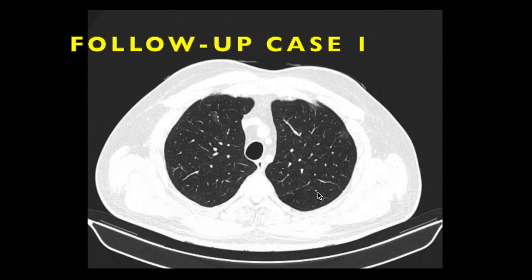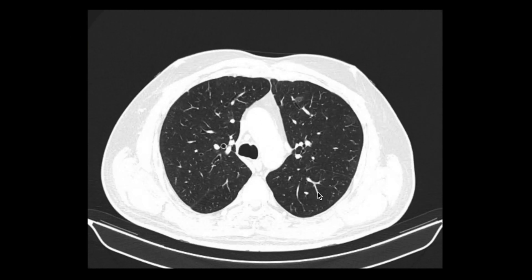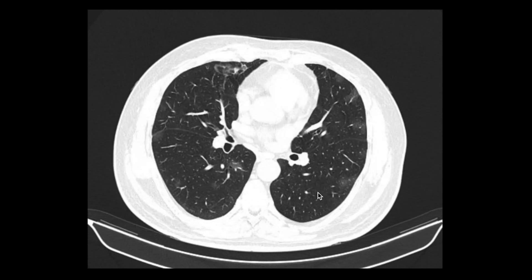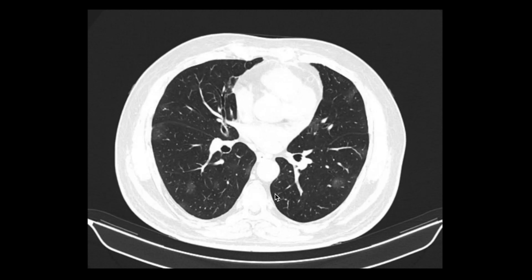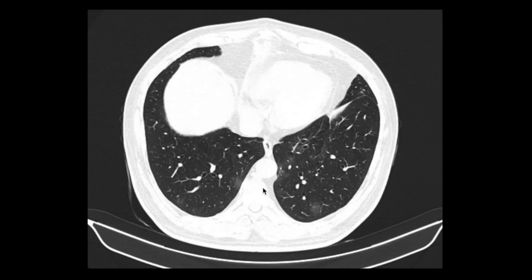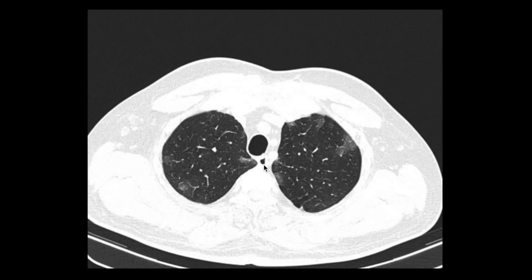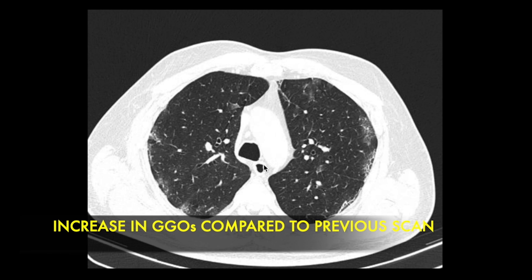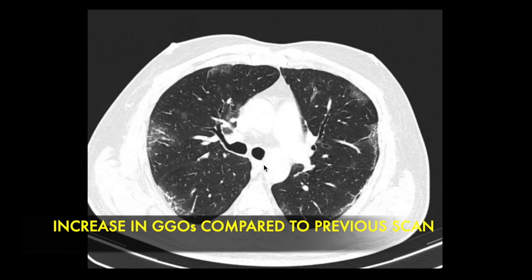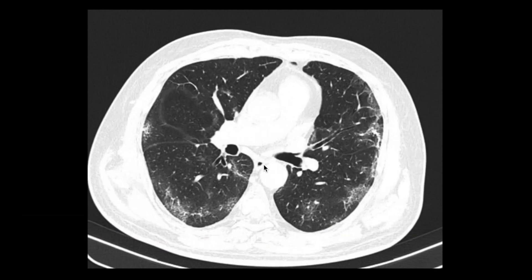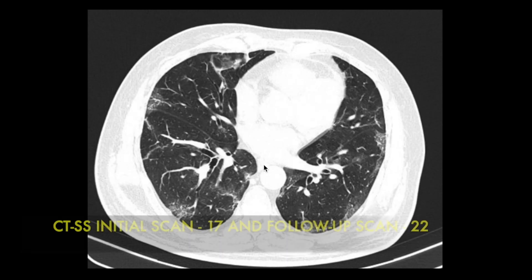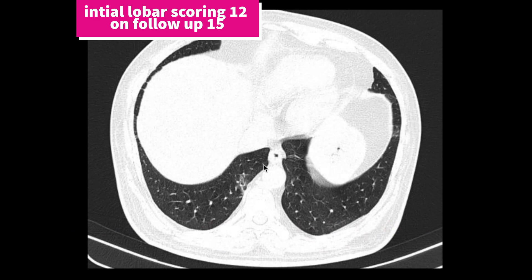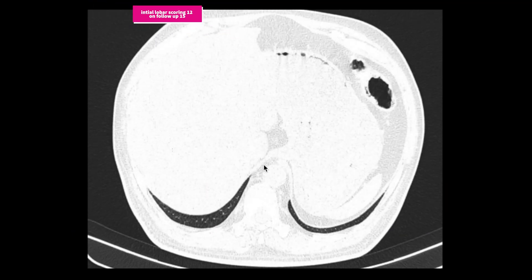This RT-PCR proven case of COVID-19 presented with breathlessness, fever, and sore throat. HRCT demonstrates multiple peripherally arranged ground glass opacities in both lungs. A follow-up HRCT taken after 5 days clearly shows an increase in ground glass opacities and crazy paving pattern. The CT severity score increased from 17 to 22, indicating worsening of the disease.